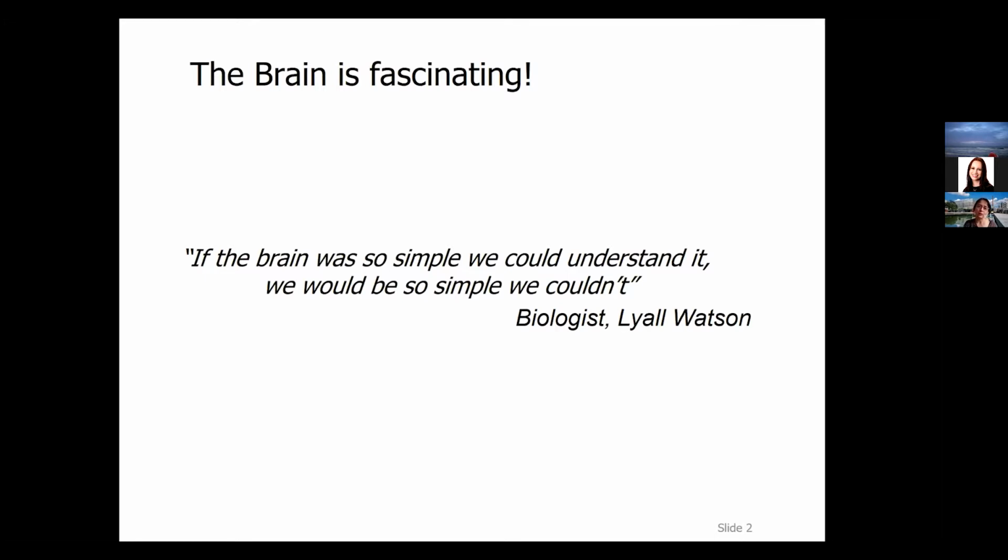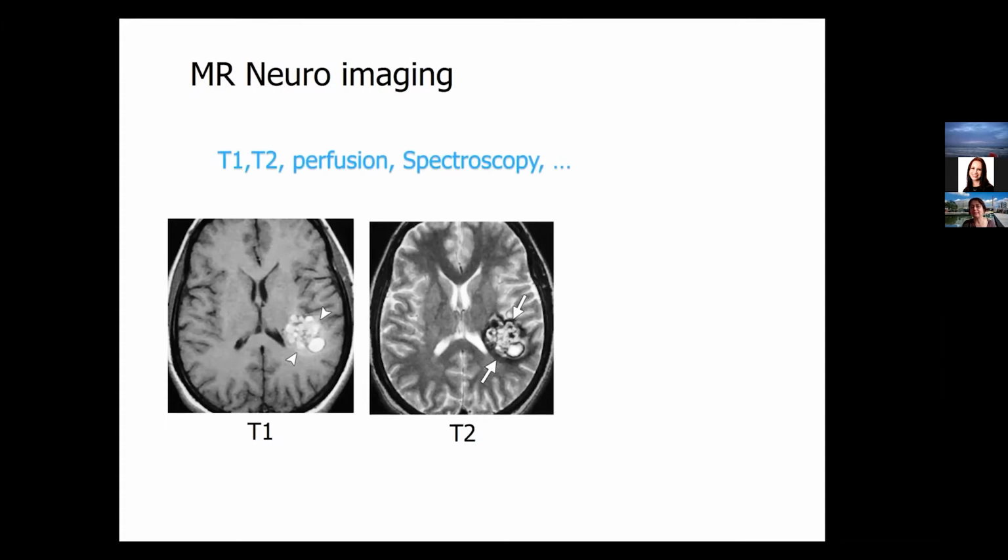And what I will present today is a tool that is also being used to try to understand the brain. If we look at imaging, we have magnetic resonance imaging, which is one of the most commonly used modalities for brain analysis. In the clinic, we have different modalities: T1, T2, perfusion, spectroscopy, all of them giving different views on the brain tissue and the functionality of the brain.